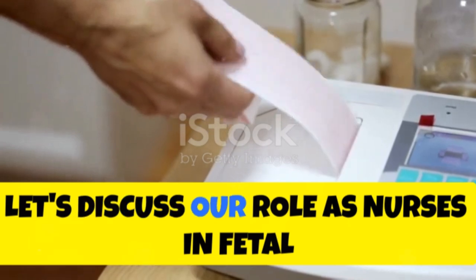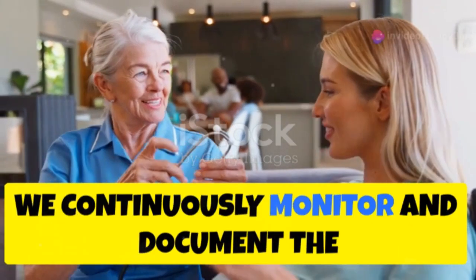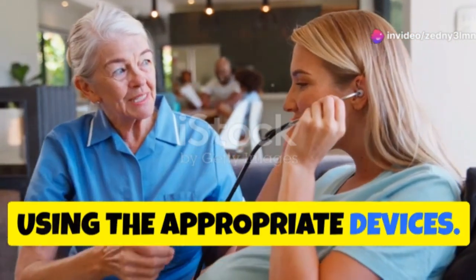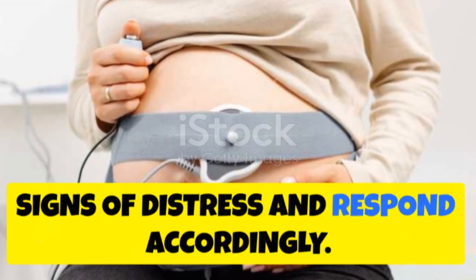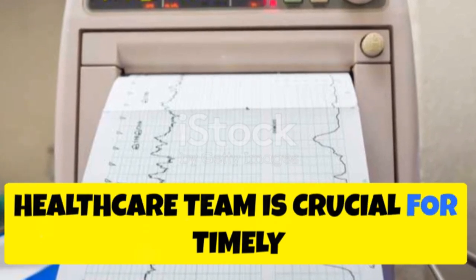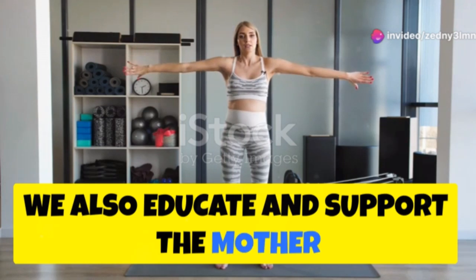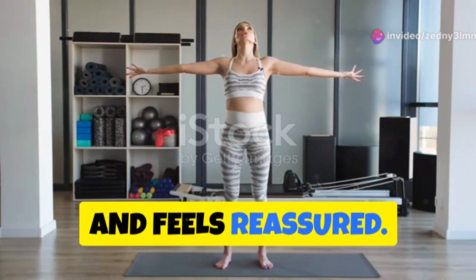Now, let's discuss our role as nurses in fetal heart rate monitoring. We continuously monitor and document the fetal heart rate and uterine contractions using the appropriate devices. Interpreting the data helps us identify signs of distress and respond accordingly. Effective communication with the healthcare team is crucial for timely updates and interventions. We also educate and support the mother throughout the process, ensuring she understands what's happening and feels reassured.